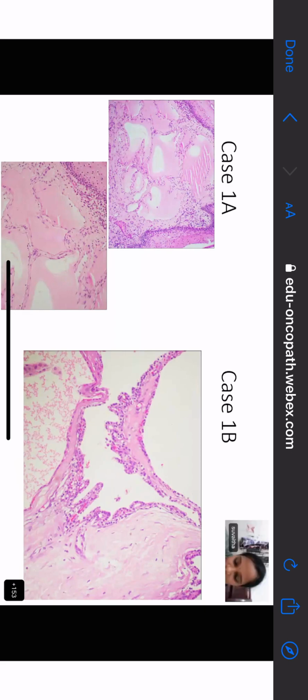These two features that you saw, they are going to ask you, and I'm asking on their behalf, why do those two features make it an epithelium? I'm not sure, ma'am.